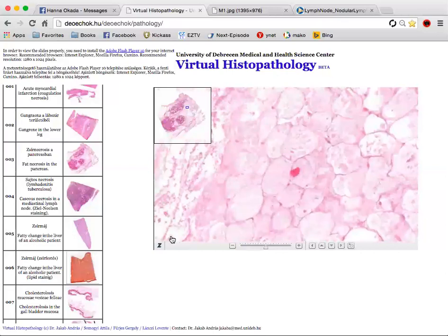What happened here is there was an acute inflammation, acute pancreatitis, which led to pancreatic enzymes being released and activated in the tissue. They reacted with the fat inside these adipocytes, and it created this. So these cells are full of calcium soaps, and the process is called saponification.